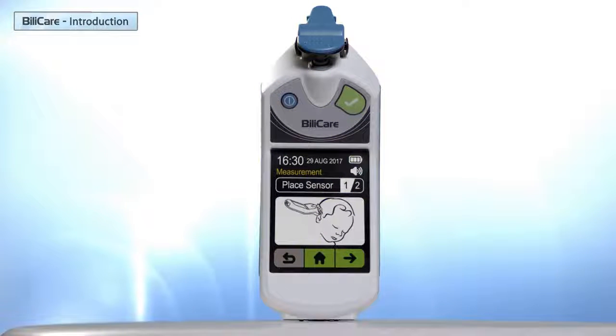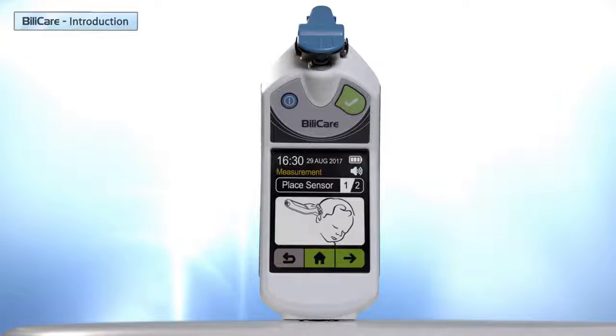This is the Bilicare screen. The upper part displays the following information: current time, current date, battery status, and buzzer status. In most screens there are three keys at the lower part of the screen: back key, home key, and next key.